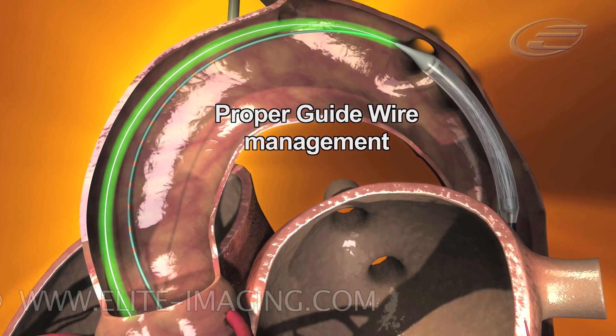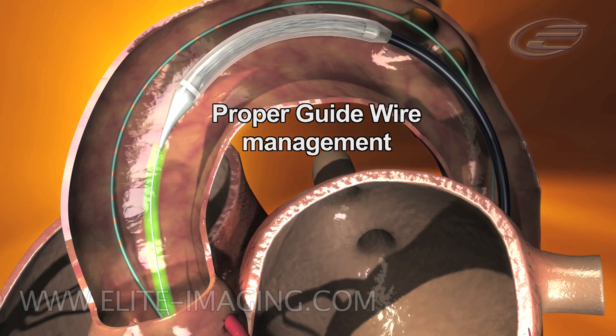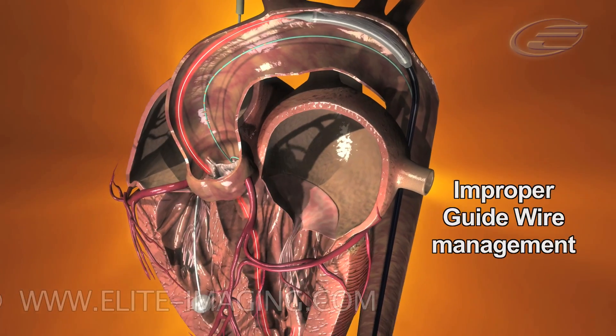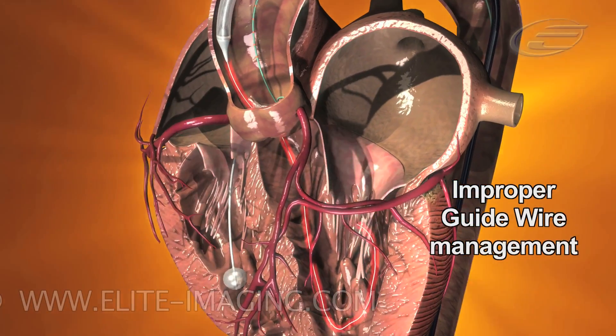When crossing the aortic arch, it is critical that the second operator controls the guide wire and prevents it from moving forward. Without proper management, the guide wire will move forward, possibly causing trauma to the left ventricle.